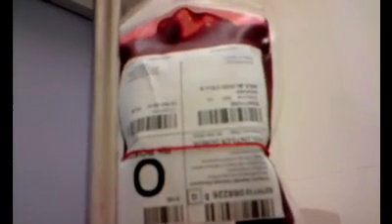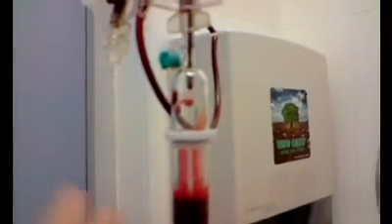I just thought I'd do another video of the speed of transfusion drip. This is my first unit — it's 260 ml. The speed of transition normally, you just estimate roughly how many — for this it's kind of average, I think, because I'm standing up and my positioning is like standing up.